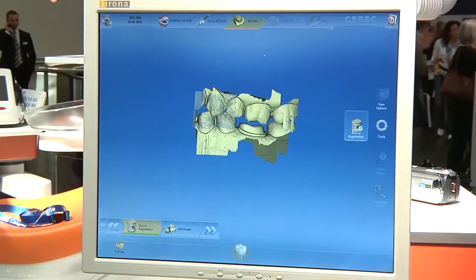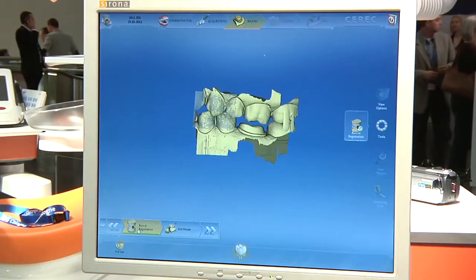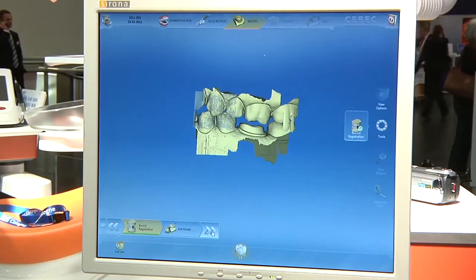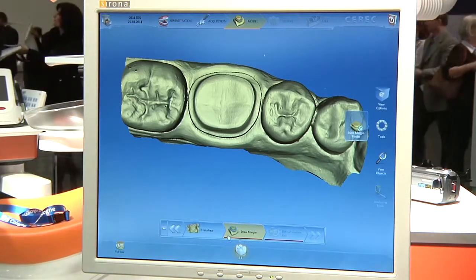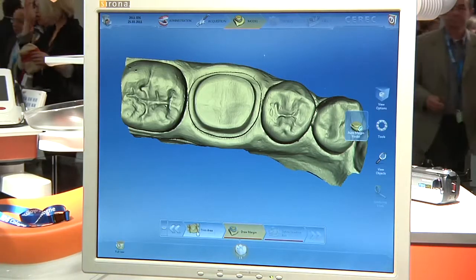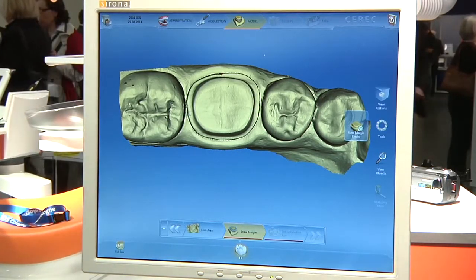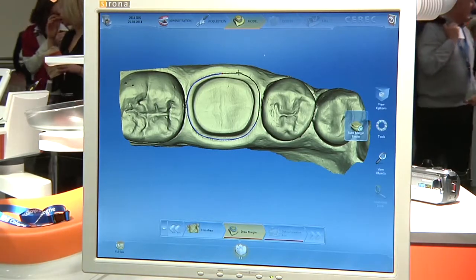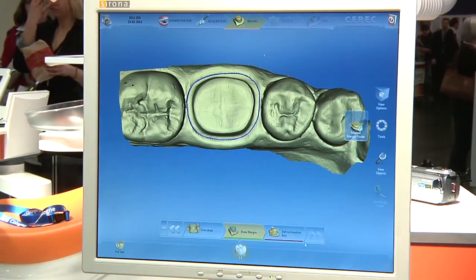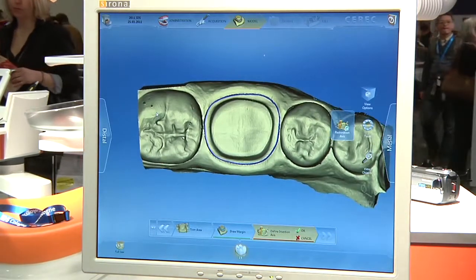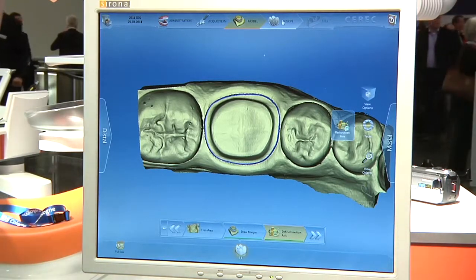As you notice here, rather than in previous softwares, I could actually go in and edit models here. Since this is not over my prep, I'm not going to concern myself about it. Now I can arrow ahead because I've accepted everything. Notice down here we're in red, so that means this is a step I need to take care of. I don't necessarily need to trim, but I'll go ahead and draw my margin line. The margin line is now in green. I will now define my axis, and once I give the okay, the design process will take over.